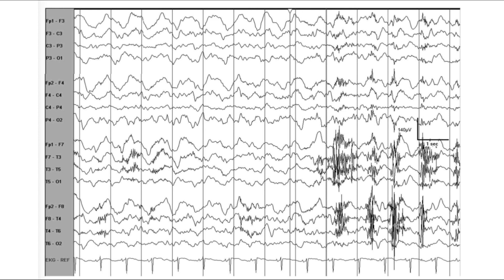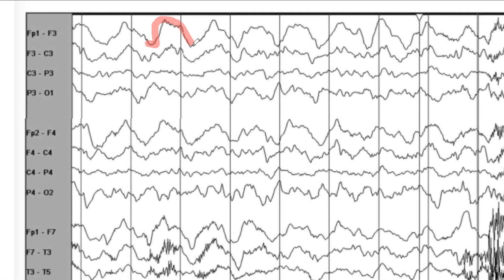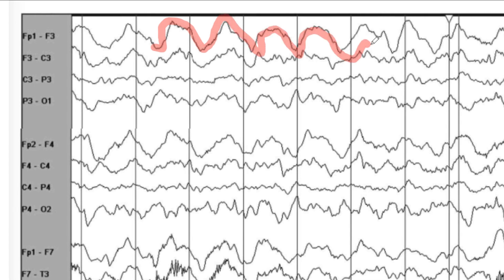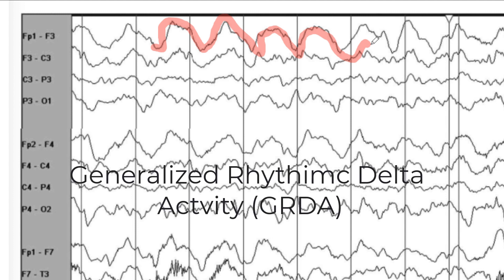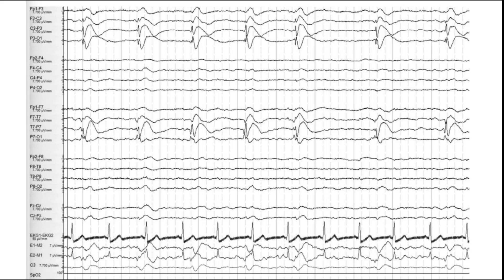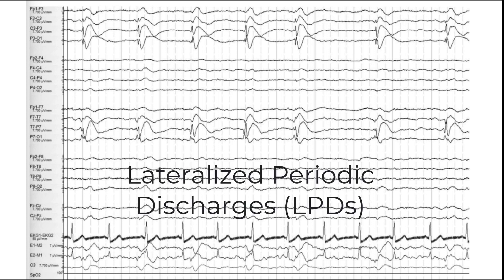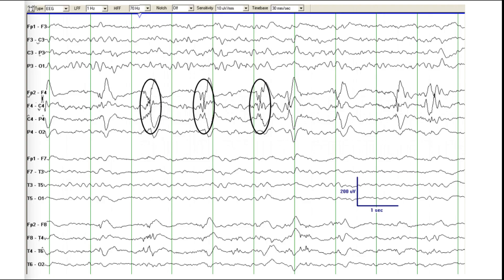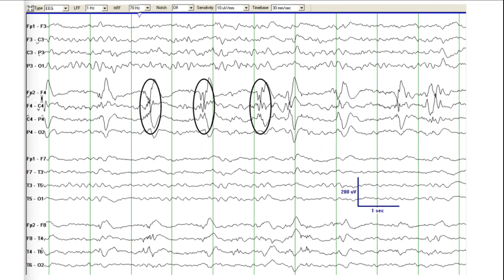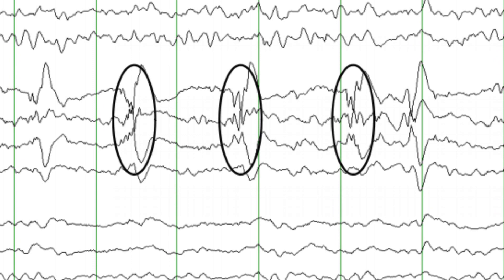This next pattern is also generalized and roughly symmetrical in both hemispheres, but is clearly rhythmic with a continuous pattern and no inter-discharge interval — therefore we call this generalized rhythmic delta activity, or GRDA. Here is a pattern present almost exclusively in one hemisphere with discharges followed by an inter-discharge interval — lateralized periodic discharges, maximal in the left posterior head region. Another example of lateralized periodic discharges maximal in the right frontal region has associated fast activity with each discharge, so we add the modifier plus F.